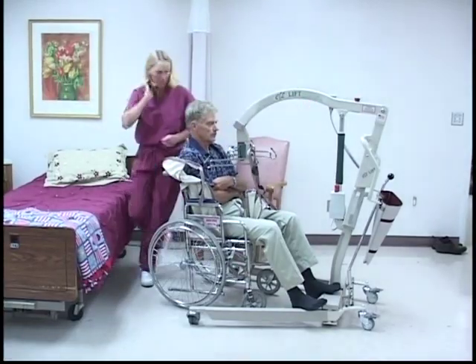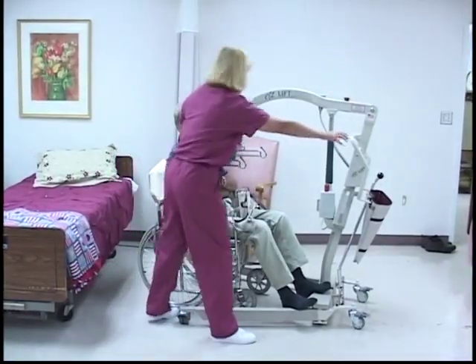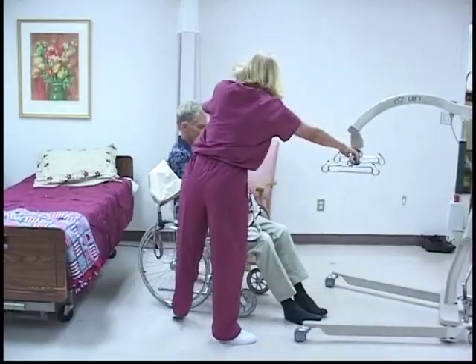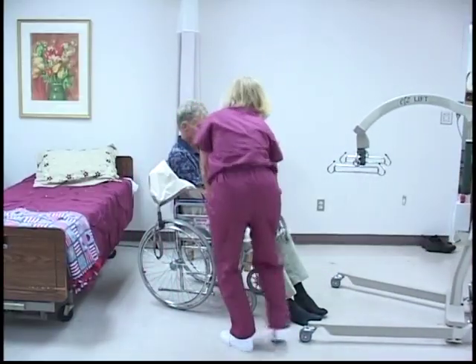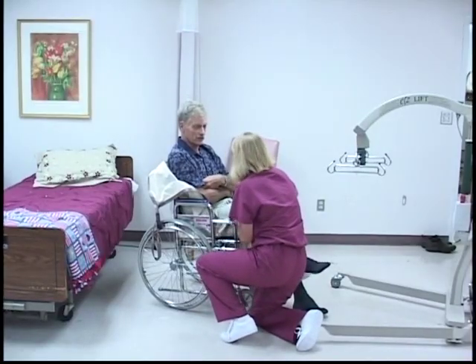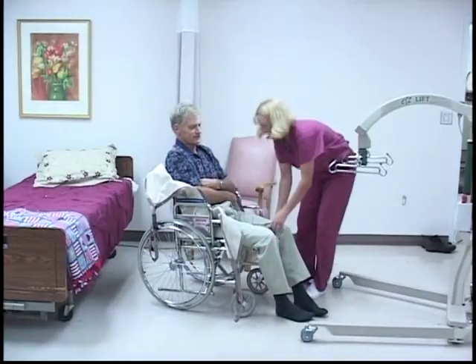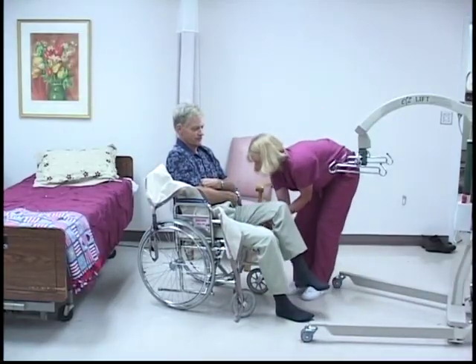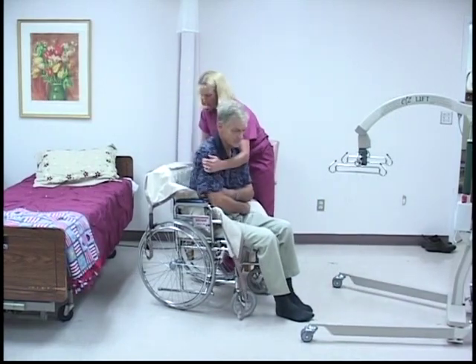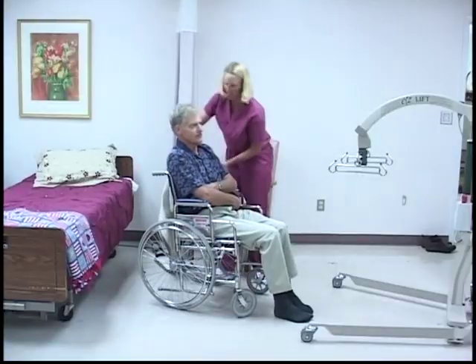Unhook the sling from the Easy Lift and back the lift away from the patient. Lift the patient's knees, pulling the sling wings out from underneath the patient's thighs. Lean patient slightly forward and grasp the top of the sling and pull the sling out from behind the patient. If you choose to leave the sling in the chair with the patient, simply tuck the wings between the patient's legs and the sides of the chair.